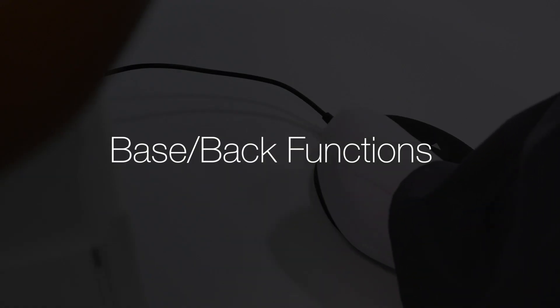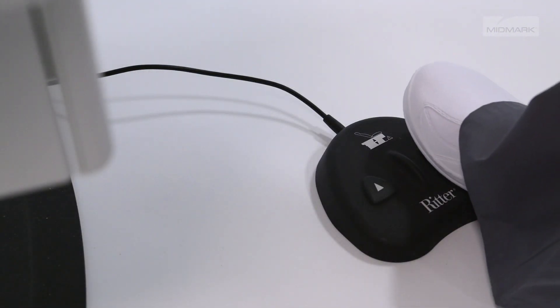To operate the base and back functions, press and hold the up or down arrow button on the foot control.